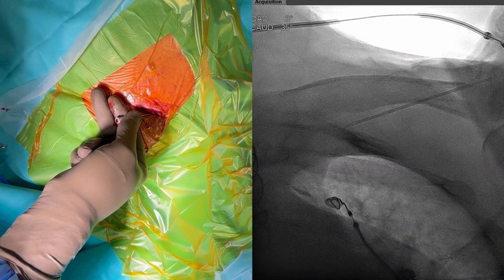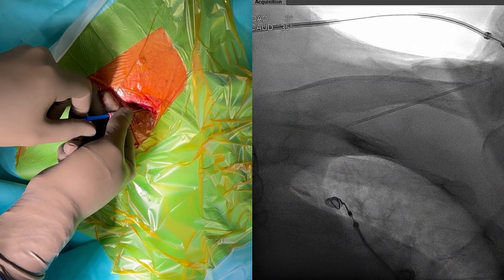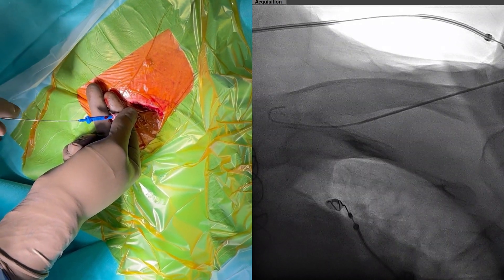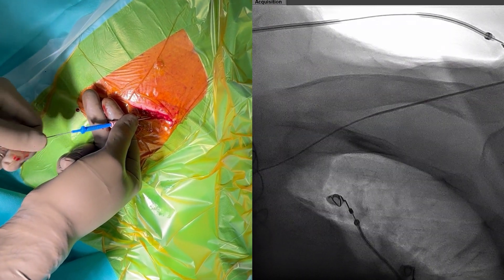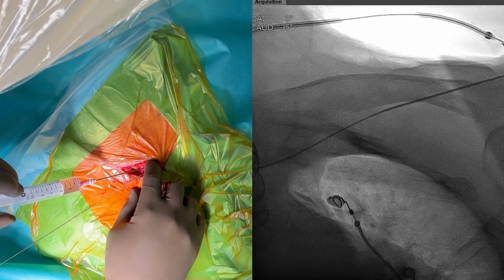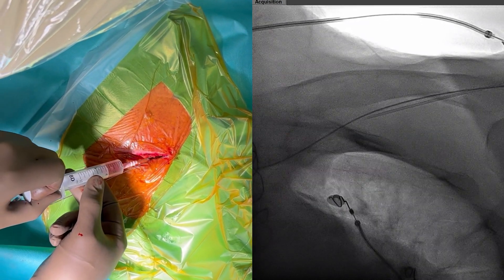After venous blood returned into the syringe we can now advance the guide wire. Be careful not to advance the guide wire into the jugular vein but rather downwards to the superior caval vein. Note also how the puncture has at least a 30 degree angle as compared to the skin, typical for axillary vein punctures.